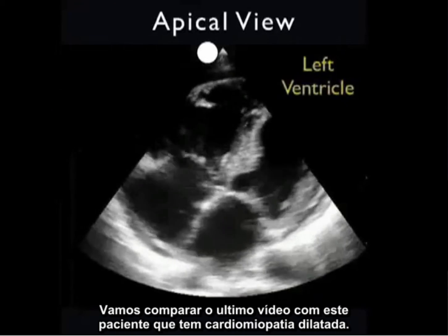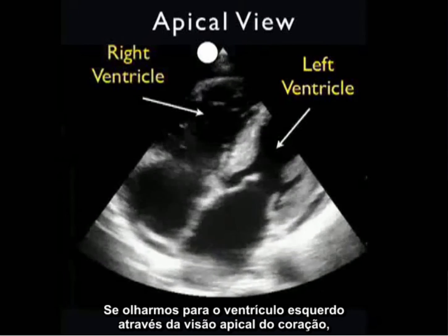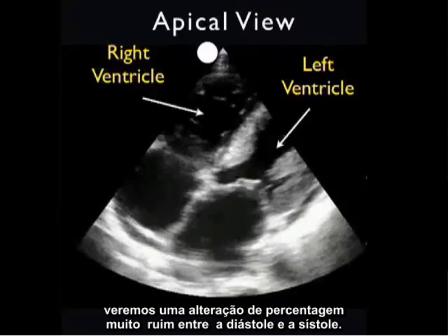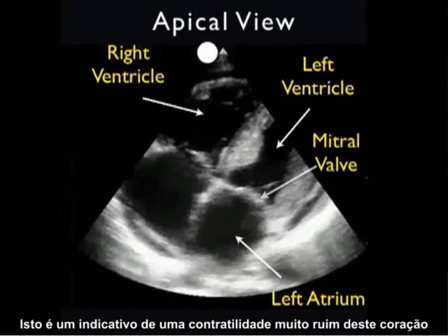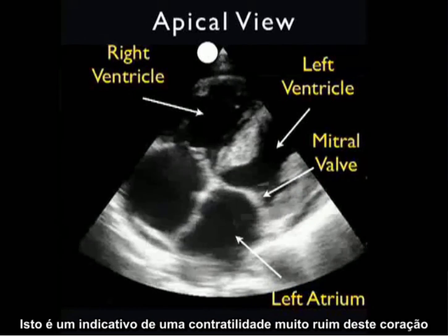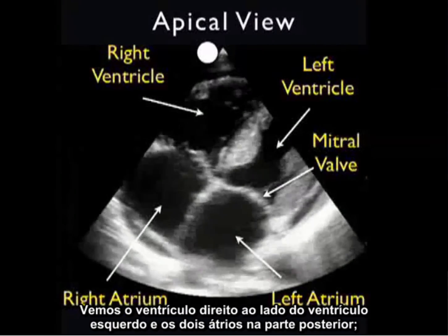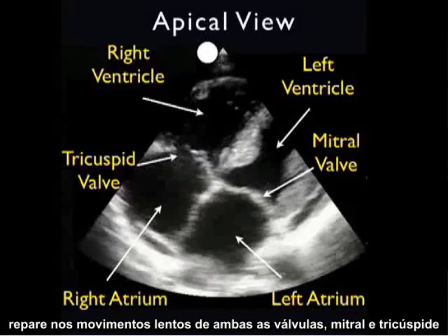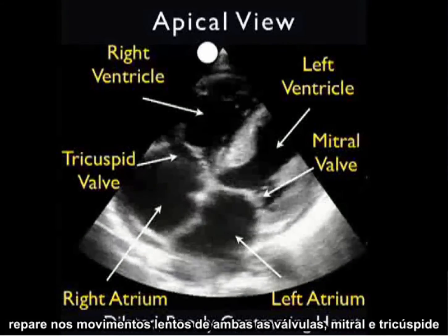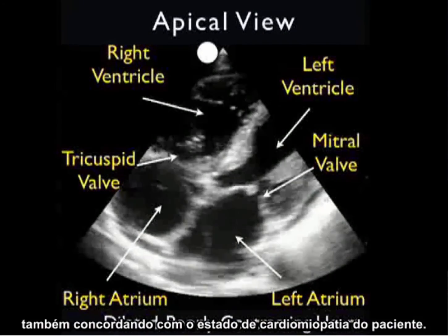Let's contrast that last clip with this patient who has a dilated cardiomyopathy. As we look at that left ventricle from the apical view, we see a very poor percentage change from diastole through systole. This is indicative of a very poor contractility of this heart. We see the right ventricle to the side of the left ventricle and the two atria posterior. Notice the sluggish movement of both the mitral valve and the tricuspid valve. We see a little bit of pericardial effusion — that little black rim around the heart — also consistent with this patient's cardiomyopathy status.